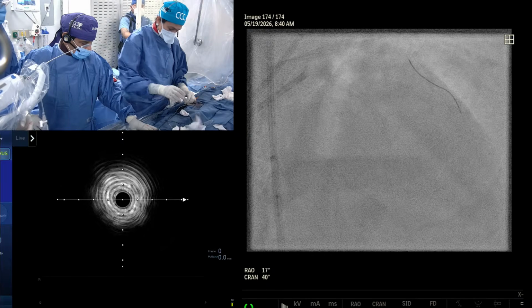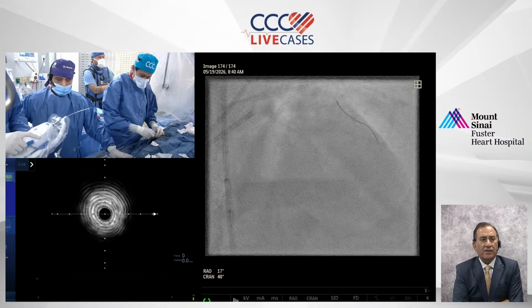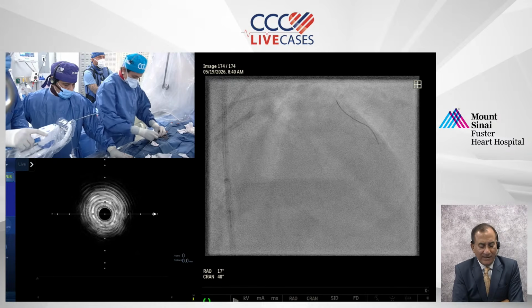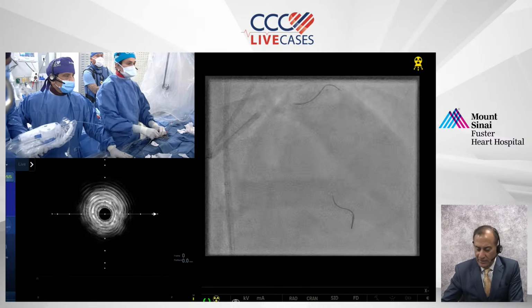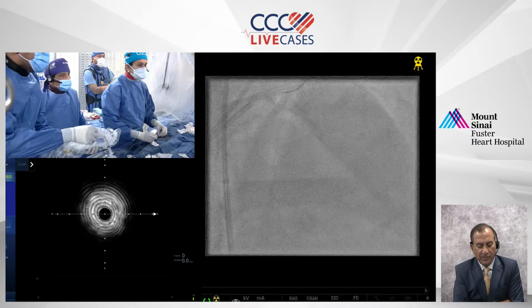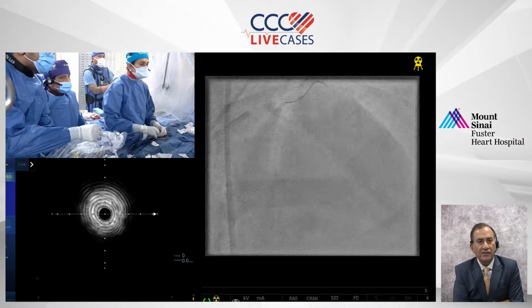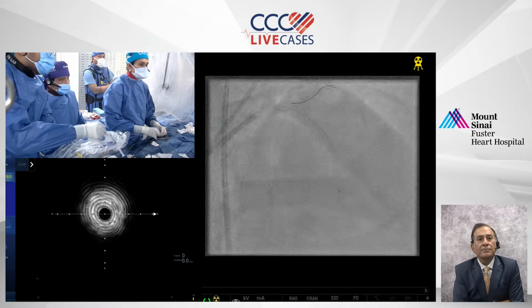So, a very basic foundational question again posed by Dr. Mohammed. I kind of understand where he's going with that, but he specifically wants you to explain how you judge the amount of pulses needed to modify a specific lesion. That's a very important point.